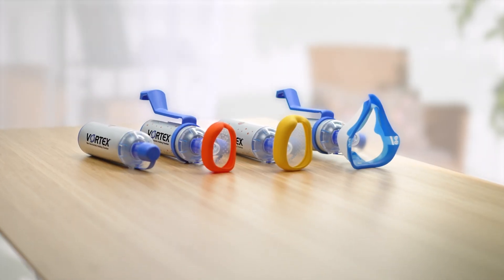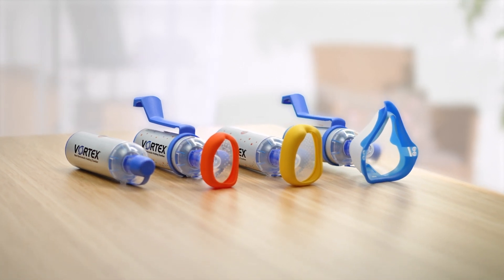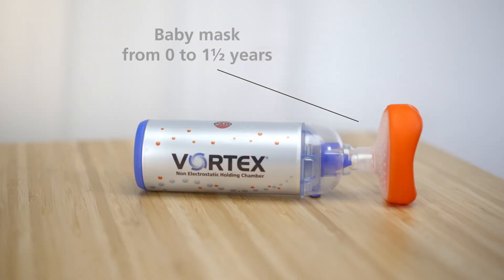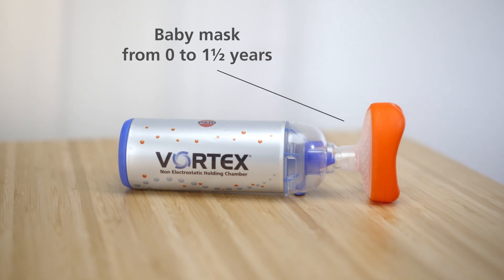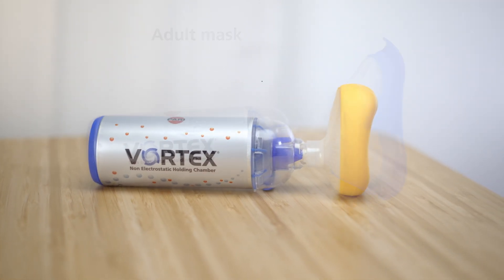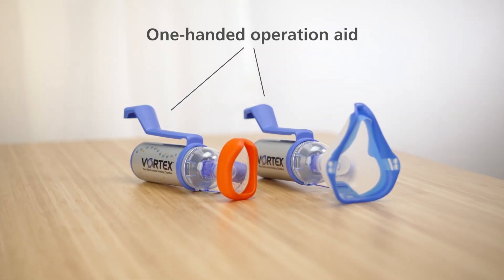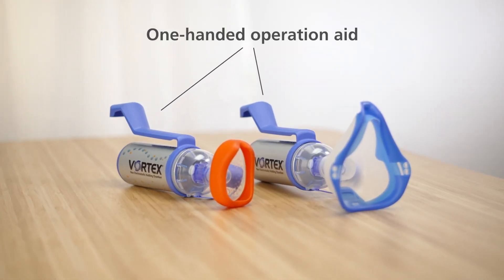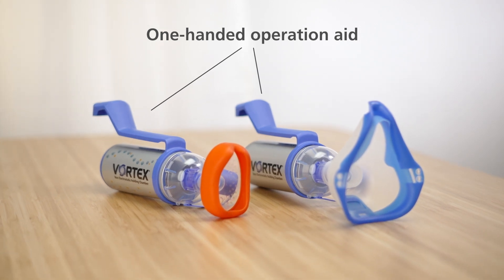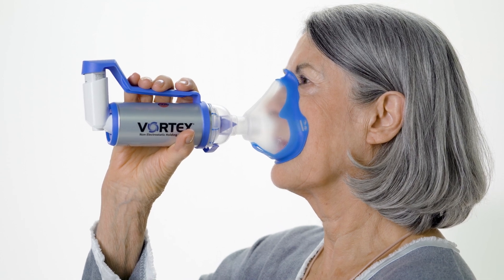To meet the needs of different age groups, there's a range of accessories available for the Vortex: a baby mask from newborn to one and a half years, a children's mask from age one to four years, and an adult mask. The patented one-handed operation aid makes inhalation with babies easier and can be operated with just one hand. It also supports patients with poor strength in their fingers or coordination problems.